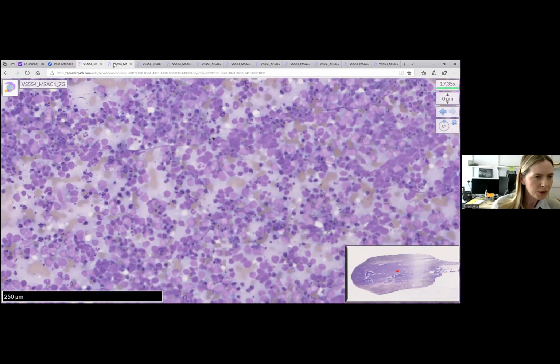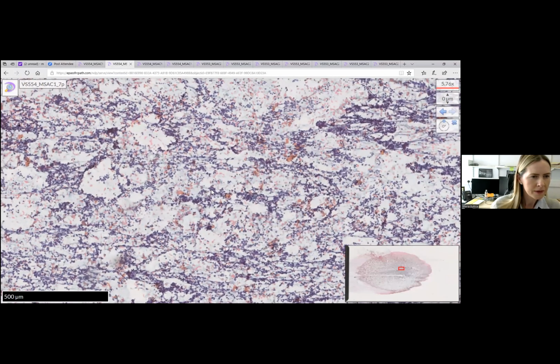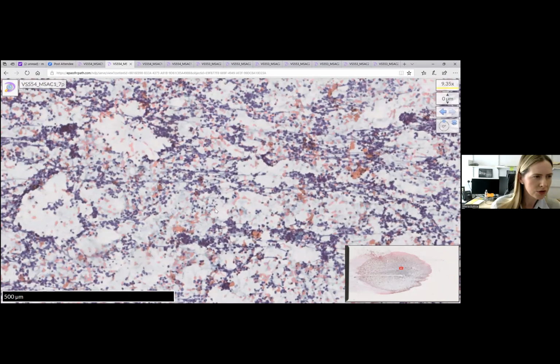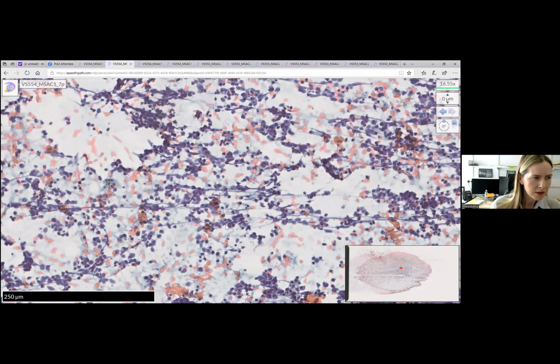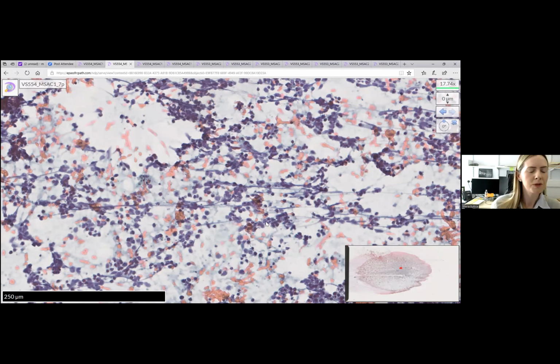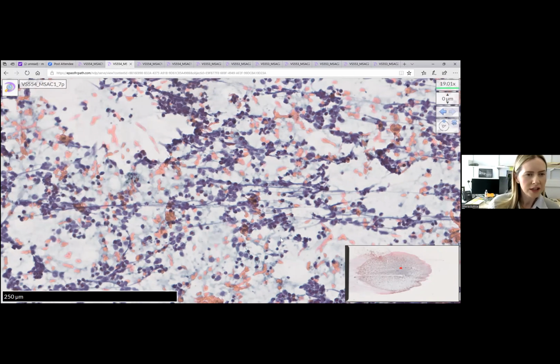Okay, and if I move you on to the PAP. I hope by now you've already got a sort of history as differential or even the diagnosis based on what you've seen on the MGG, and the PAP can just reinforce your initial impression. So I think I'll just stay at this magnification because it can actually show all the features.